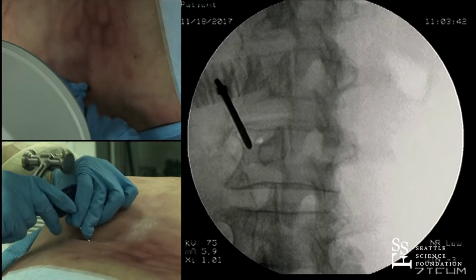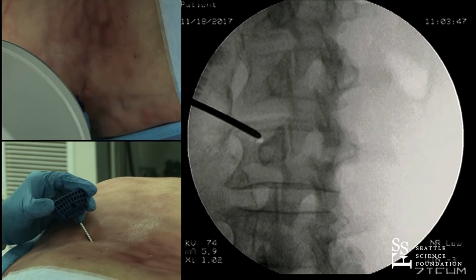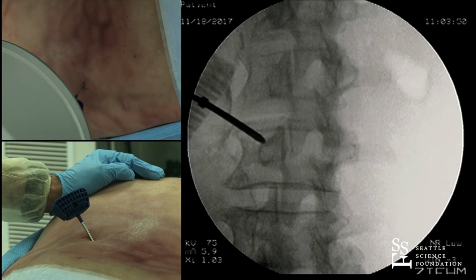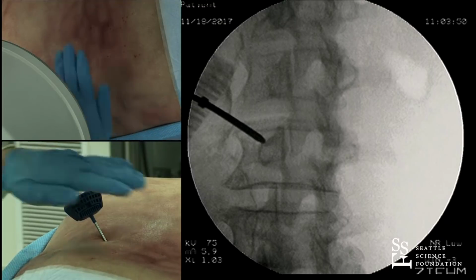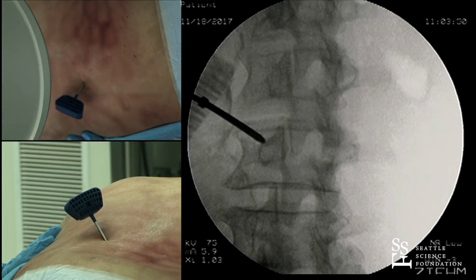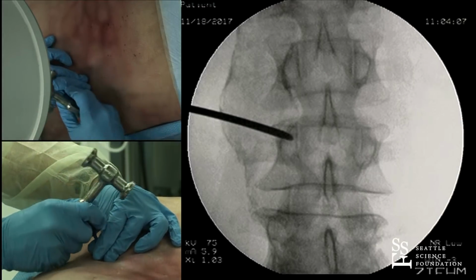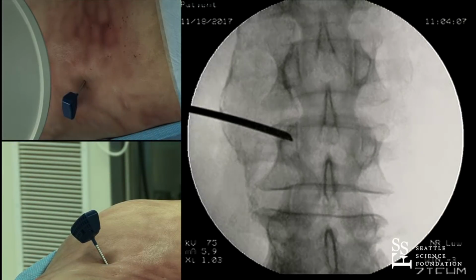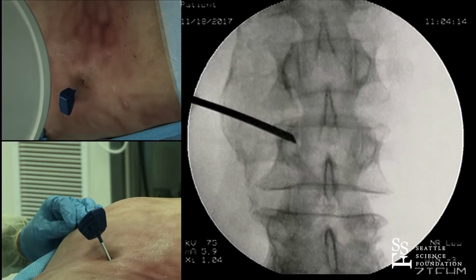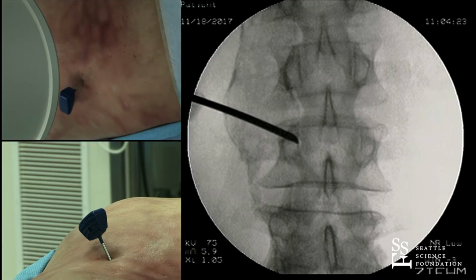That's a very nice trajectory right there. Just above the equator of the pedicle, just anterior to it. And so that's outside the pedicle at the pedicle body junction. Then after this, we're going to go directly AP. Take a shot, and that is looking pretty good right there. And keep in mind, we want to come down before we transgress the medial wall of the pedicle. We make sure we're in the posterior portion of the vertebral body by going lateral.